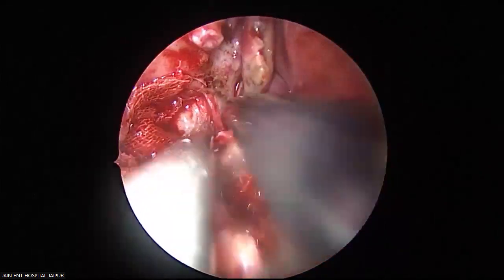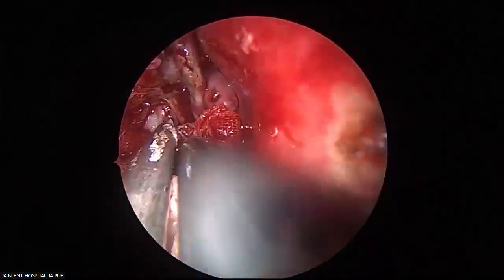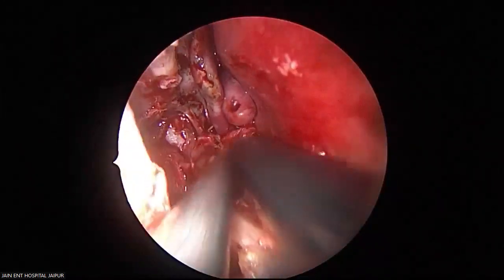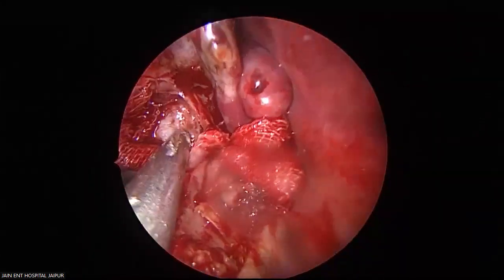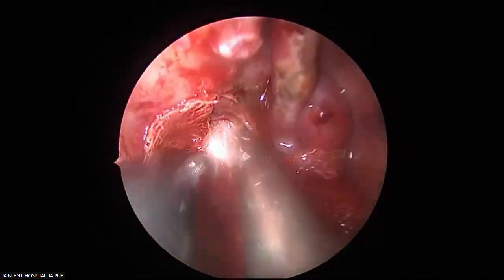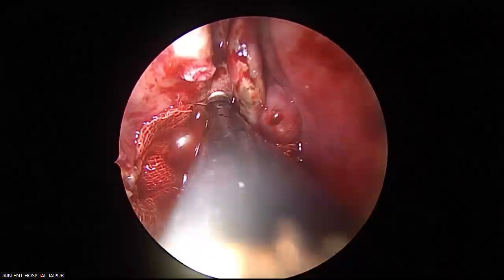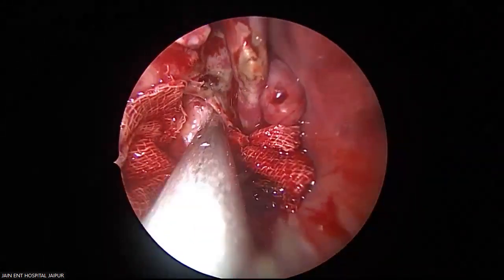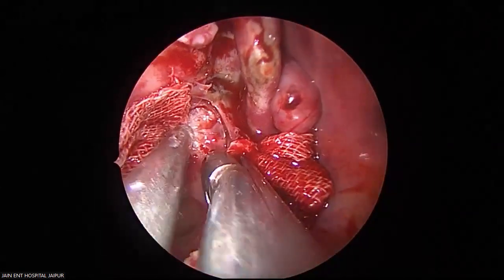See, you can keep optimizing your field by means of coagulating the mucosal surfaces. Bony surfaces you can remove. All the bones you have to remove. See this?